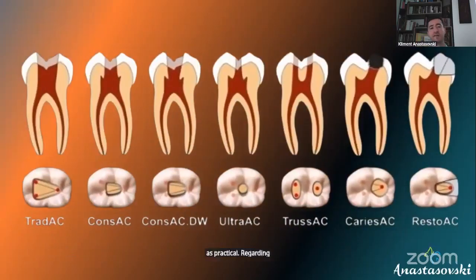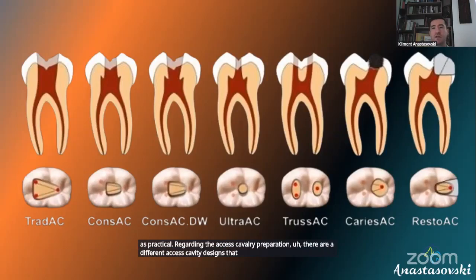Regarding the access cavity preparation, there are different access cavity designs that we need to choose from.